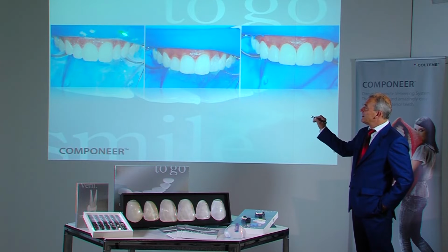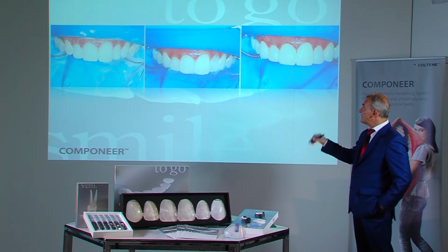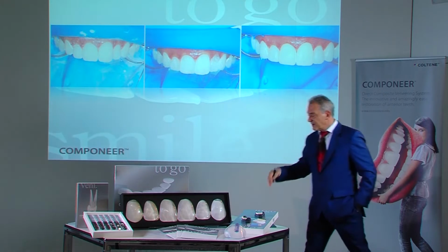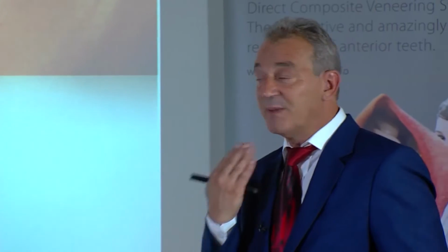The white dust represents the aluminium oxide that was used to sandblast the surfaces. This was followed by etching, conditioning, and finally all that needed doing was to apply the Componeers to the surface. These are then trimmed back slightly as we had too much material initially. The less we prepare, the more we of course come outwards with the Componeer. We need to calculate this in advance.